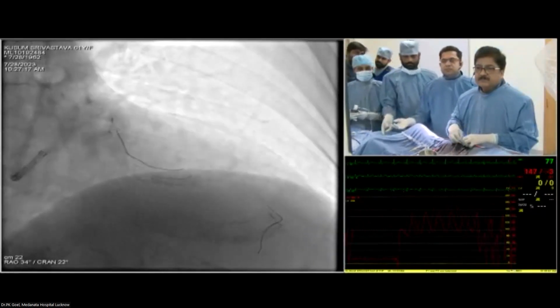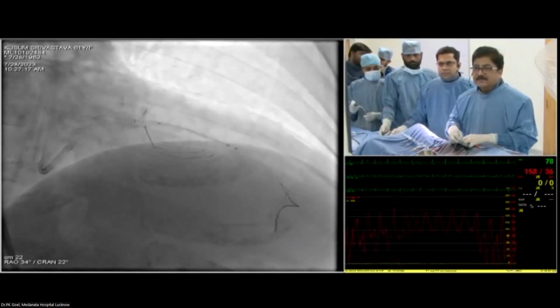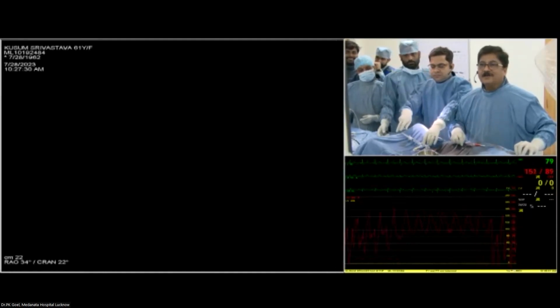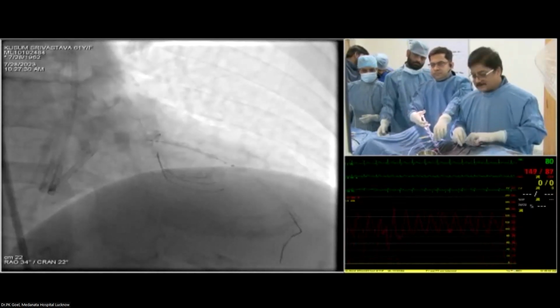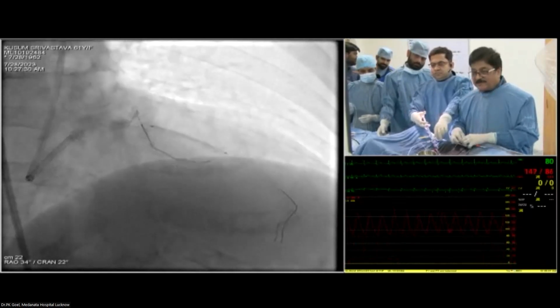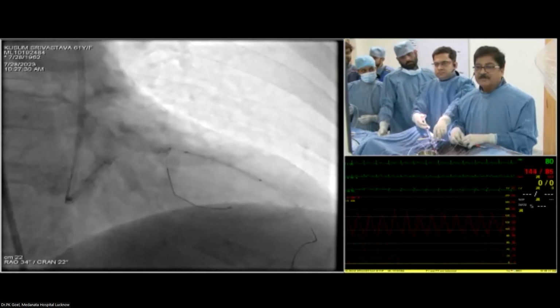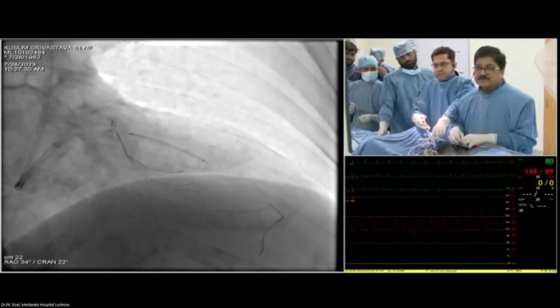So yeah, we actually published a paper, crossover stenting for ostial LAD versus precise stent placement. Crossover is definitely better. I have done these cases and the results are good. I have written that there are no comebacks or restenosis. But once it gets published, then we'll know that.